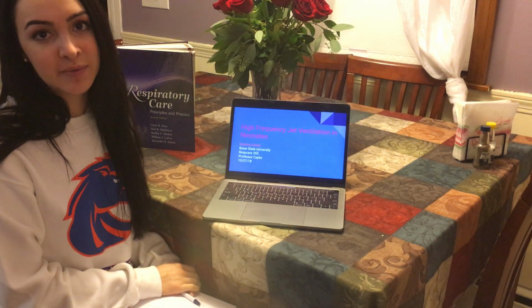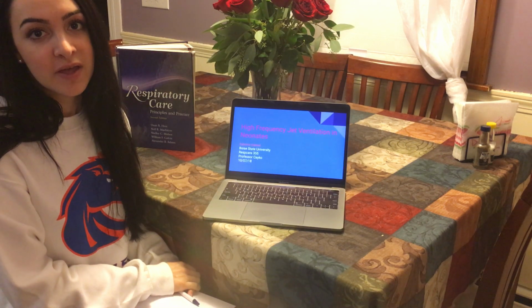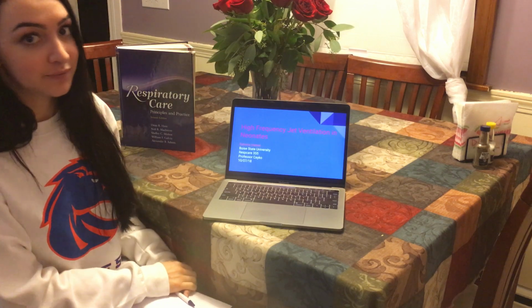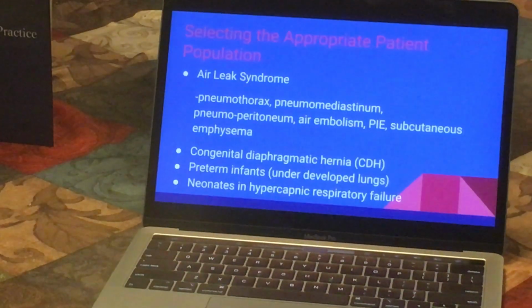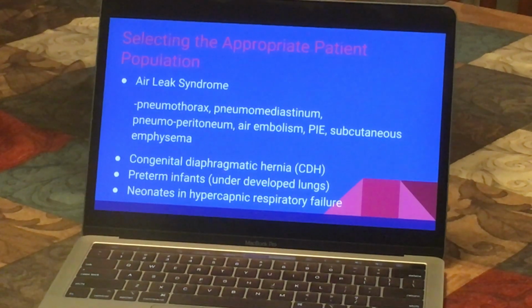I'm Sabrina Hamill, and I'm going to be talking to you guys, the class of RESPCARE 355, about using the jet ventilator in the neonatal population. So first, we'd have to talk about how we would select the appropriate patient to start the jet ventilator on.